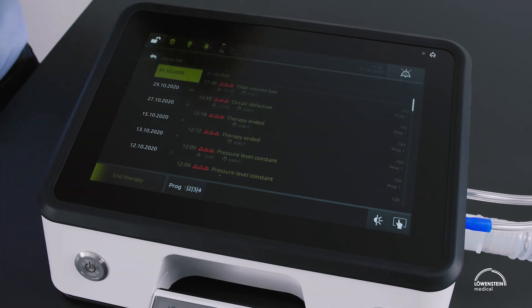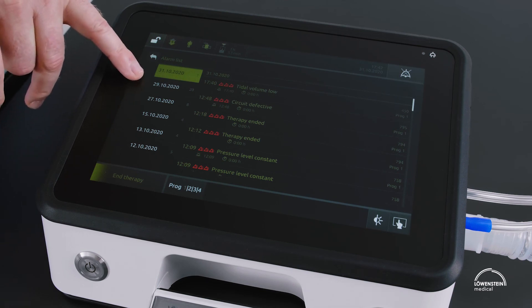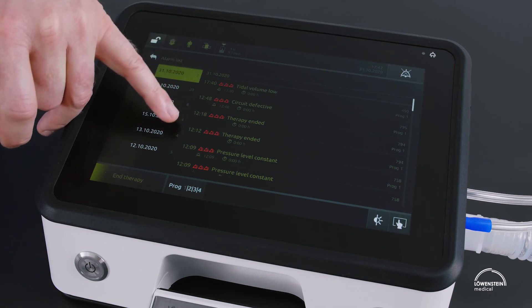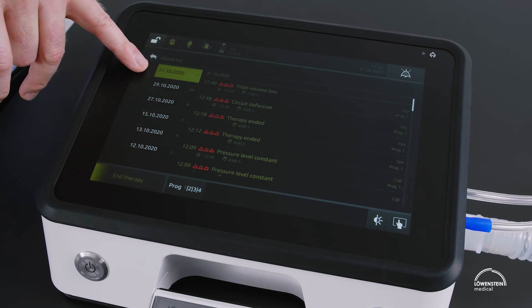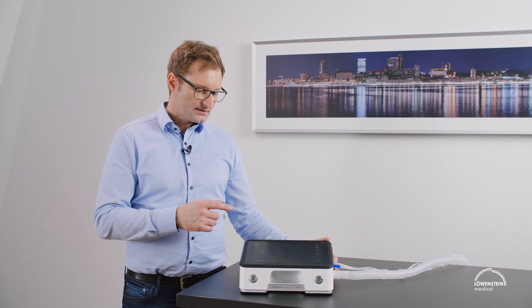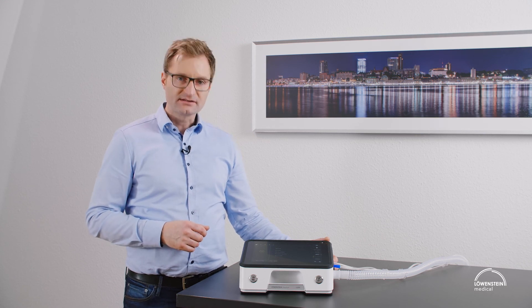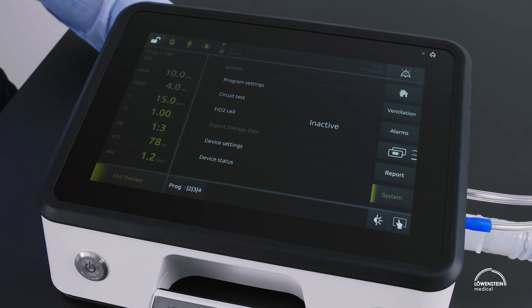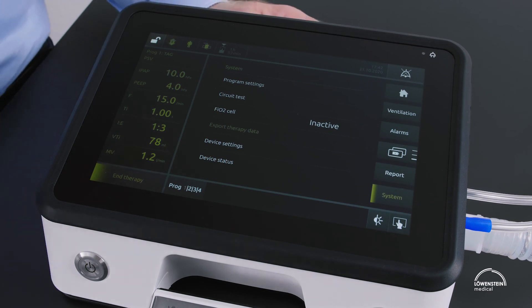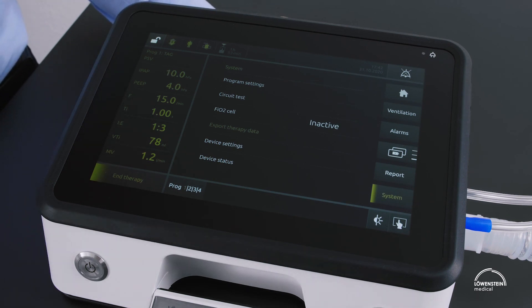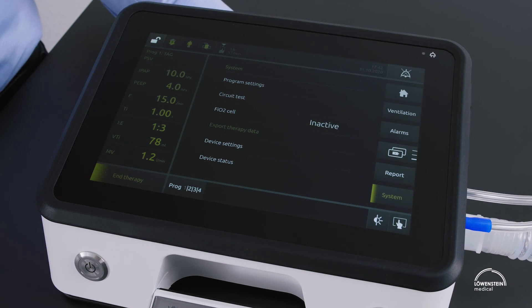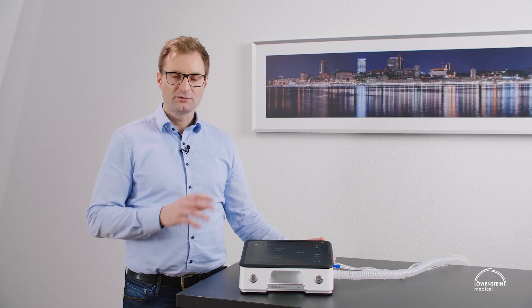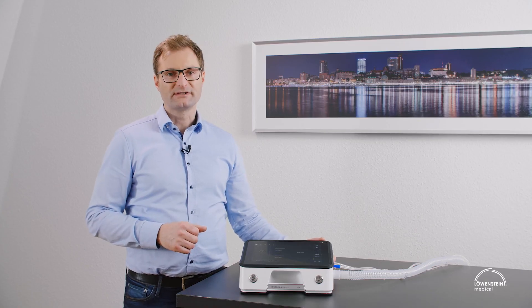In the alarm list, the dates when alarms occurred are shown, and in the middle are all the alarms that occurred on a certain date. The last menu is the system menu, where all settings not primarily related to ventilation are done — for instance, selection of programs, the circuit test, or activation of the FiO2 cell. Tutorials are available for all of these points.